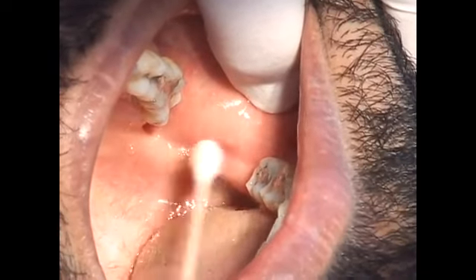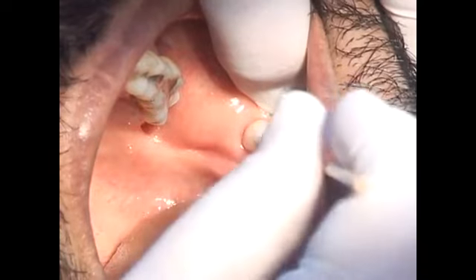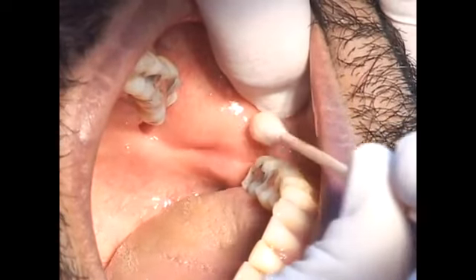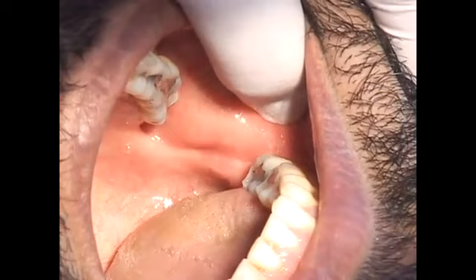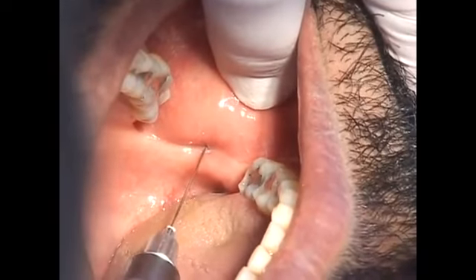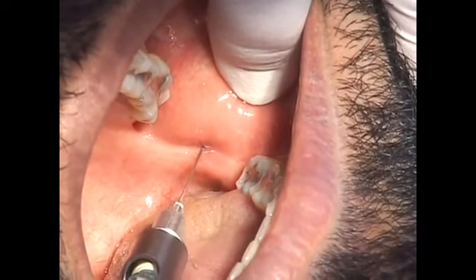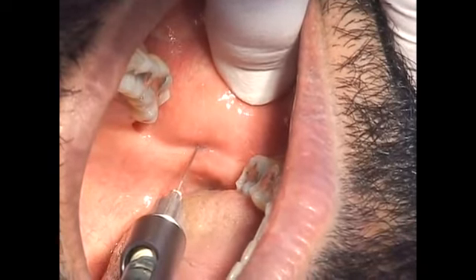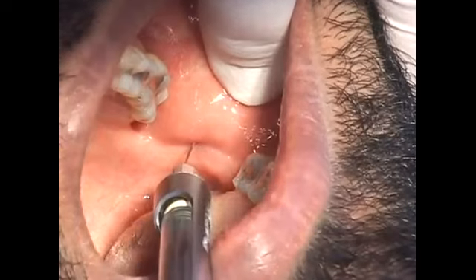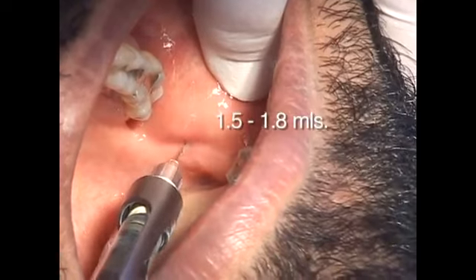Prepare the syringe with a 25 gauge long needle. Bevel orientation for this injection is not critical. Apply topical anesthetic for 1 minute. Insert the needle and advance 20 to 25 millimeters until bony contact is made. Withdraw the needle 1 millimeter, aspirate, and deposit 1.5 to 1.8 milliliters of solution.